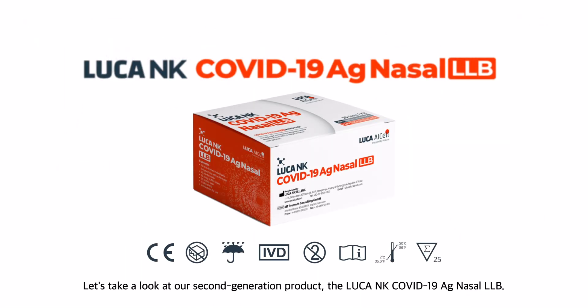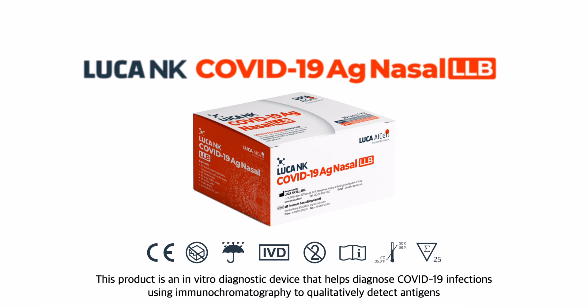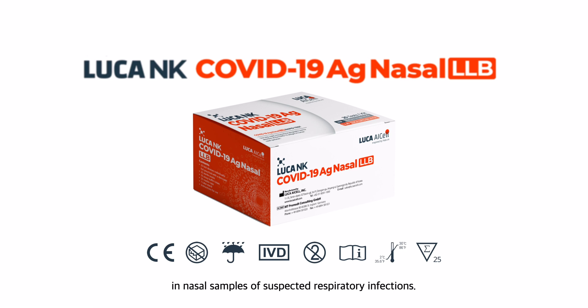Let's take a look at our second generation product, the Luca NK COVID-19 AG Nasal LLB. This product is an in vitro diagnostic device that helps diagnose COVID-19 infections using immunochromatography to qualitatively detect antigens in nasal samples of suspected respiratory infections.